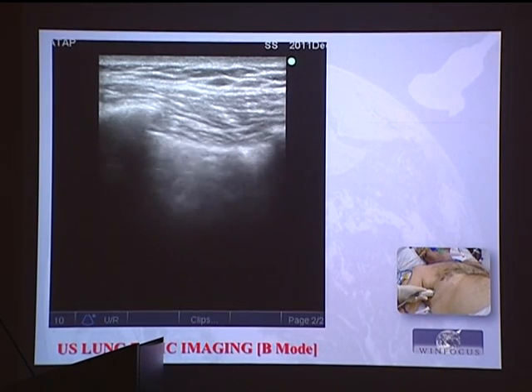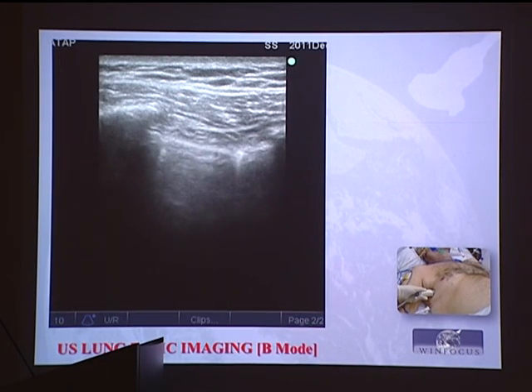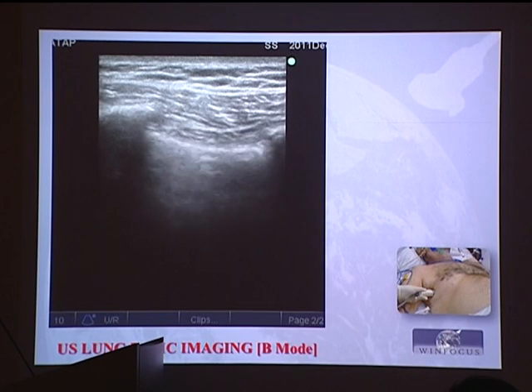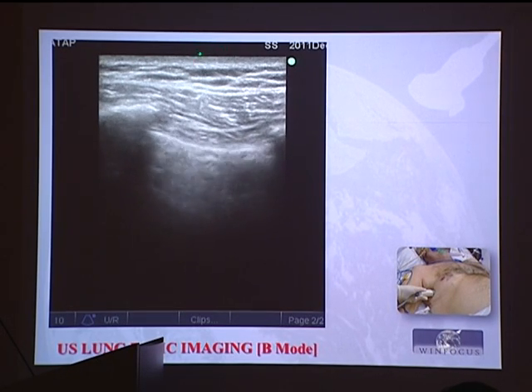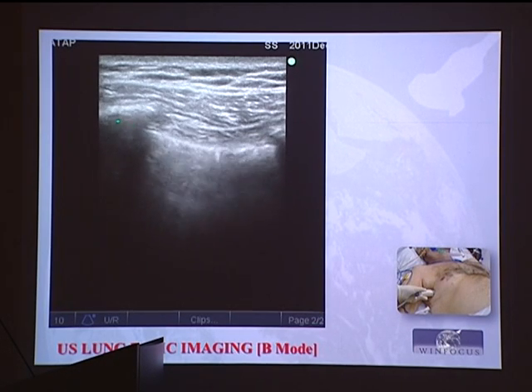This is a basic image of a transthoracic longitudinal view. Longitudinal means, okay, with a craniocaudal direction. So the 2 ribs will be cross-sectioned like that. So I will have a craniocaudal orientation with superficial and deep orientation.